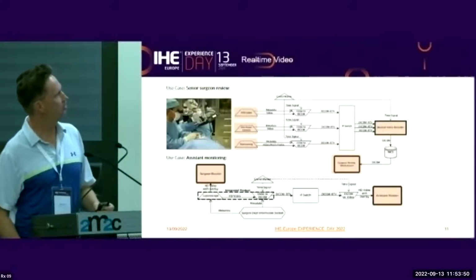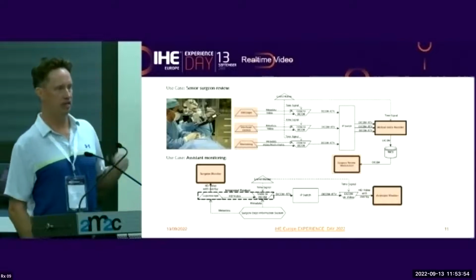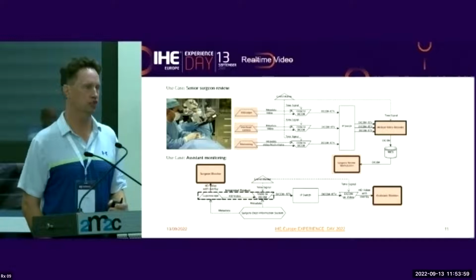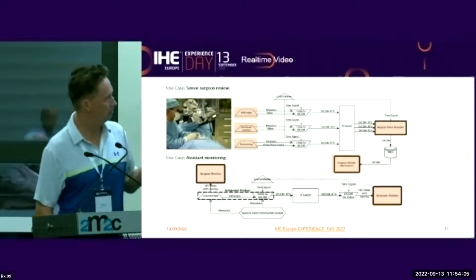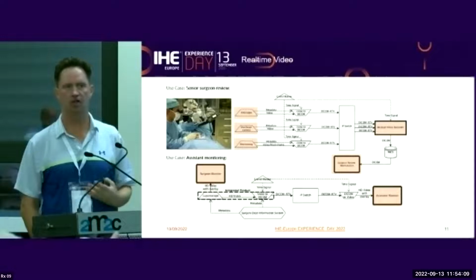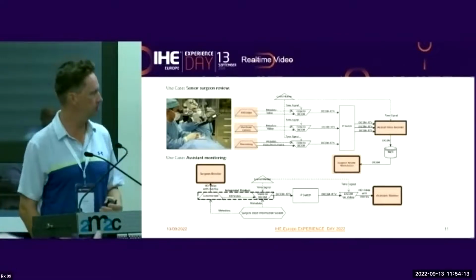And here's another interesting example, real-time video. So the idea here is to capture a lot of different video sources within the surgery room. So it can be an endoscope, it can be a head-mounted camera, it can also be different kinds of monitoring equipment, generating curves and video and so on.